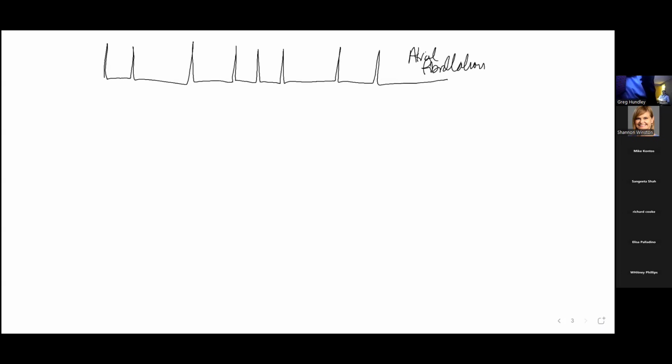Okay, so when you have patients in atrial fibrillation, do we just say we can't do it? No, we do those great. And actually the images look really pretty with a lot of variety in what the heart rate is. How do we do that? Right, well, we got to go back.